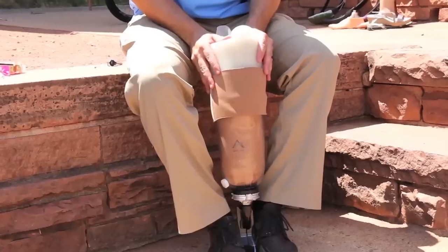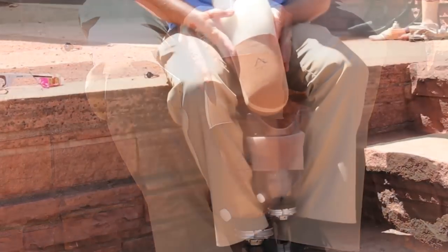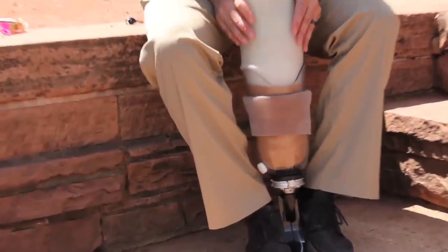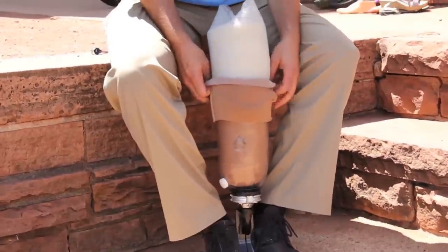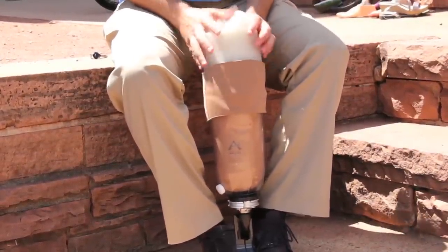Suction with sleeve suspension. This is primarily utilized in a transtibial system, but also occasionally a transfemoral system. Place the cushion liner onto your leg and then step into the prosthetic socket. Then roll the outer suspension sleeve over the top of your prosthetic socket and onto the cushion gel liner.